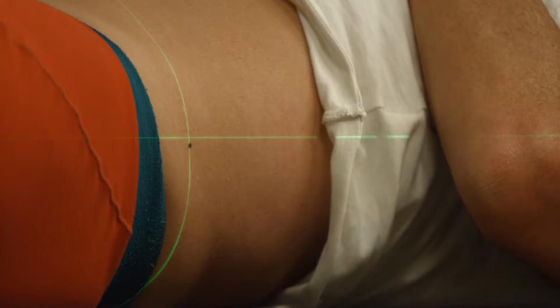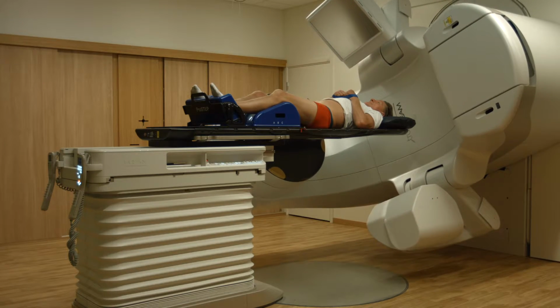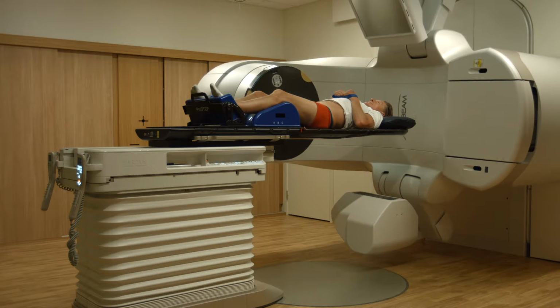The first treatment takes slightly longer, 20 to 30 minutes, as a result of the plan reviews prior to treatment. Often the actual irradiation only takes 2 to 5 minutes.